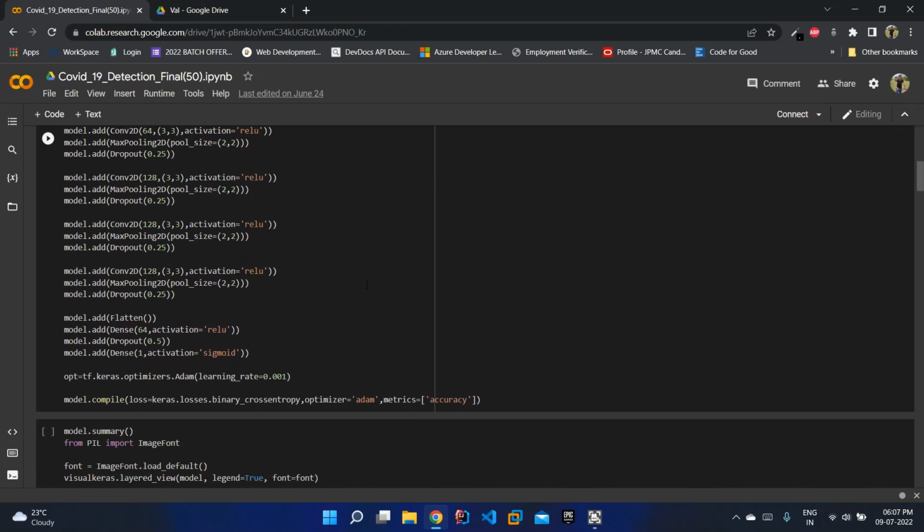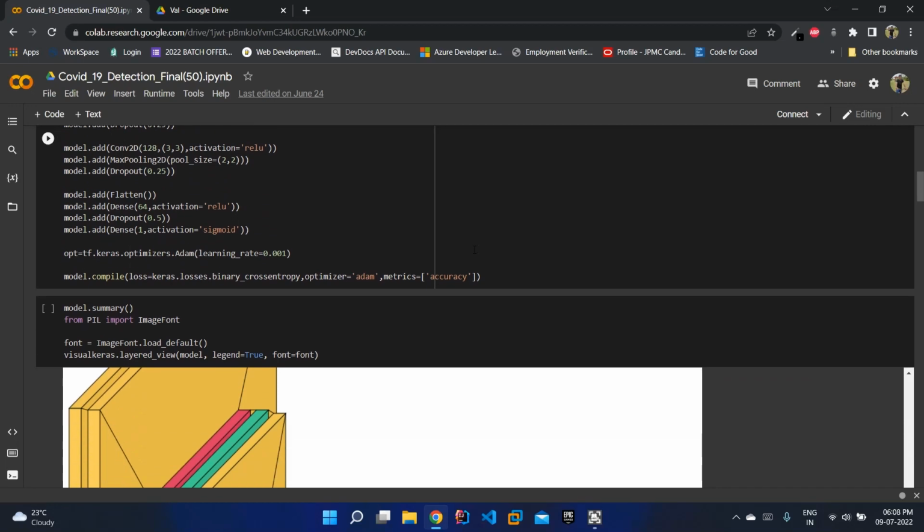These layers were all compiled into a single model using the Adam optimizer, whose learning rate was set at 0.001 in order to ensure that our model was learning optimally from the images being supplied to it without any sort of overfitting or underfitting.